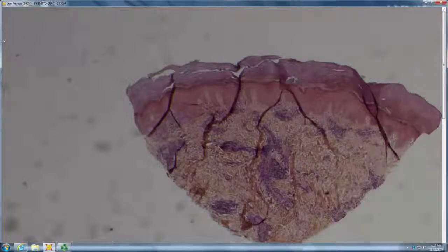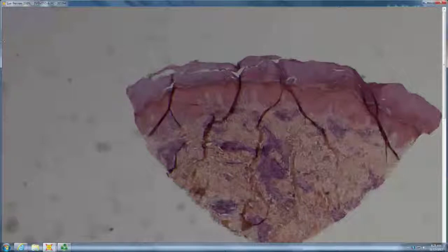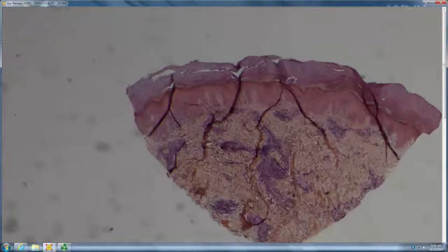Okay. So where do you think you are? Probably acral, right? And you're going to have an onion skin fibrosis picture. So onion skin fibrosis around vessels on an acral site. What are you thinking? Looks like EED, erythema elevatum diutinum, which is associated with HIV, strep, and paraproteinemias.